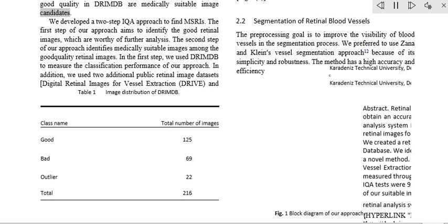We used a vertical Sobel operator to extract the vertical edge information of pre-processed retinal images, Fig 3b. We calculated the vertical edge histogram using the following formula. Figure 3: detecting candidate area of the optic disc, A, original image, B, vertical edge histogram, and candidate optic disc, OD, region of the image. Where VH denotes vertical edge histogram, G is the result of the vertical Sobel operator, N denotes the total number of rows in G, and I and J denote the row and column numbers of the image, respectively. The maximum value index of this histogram is an approximation of the horizontal center of the location of the OD.